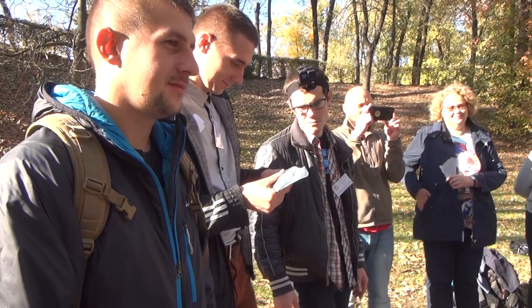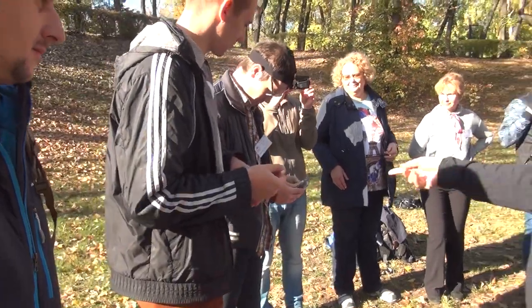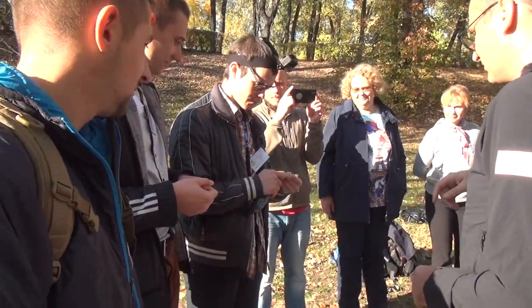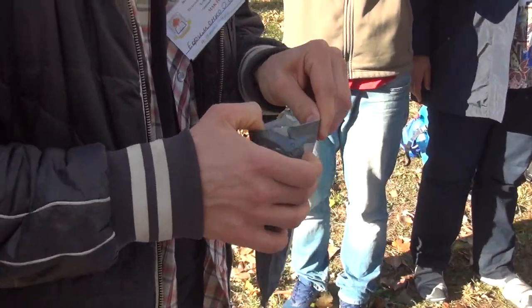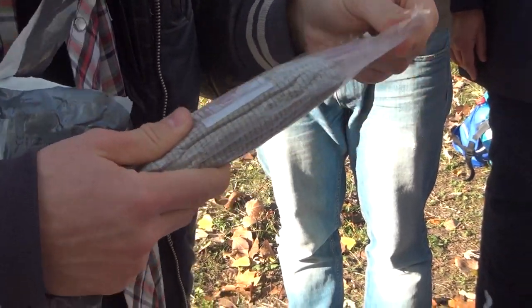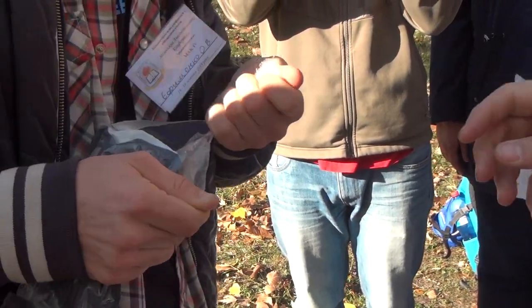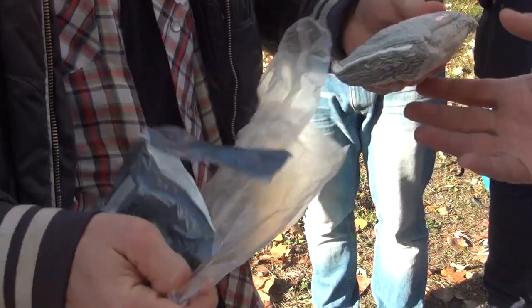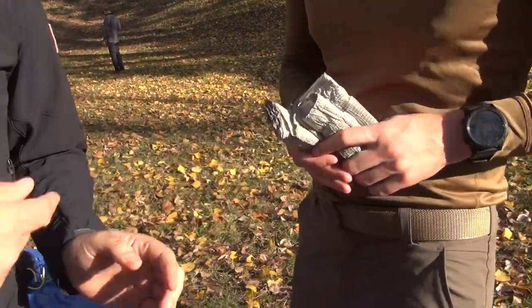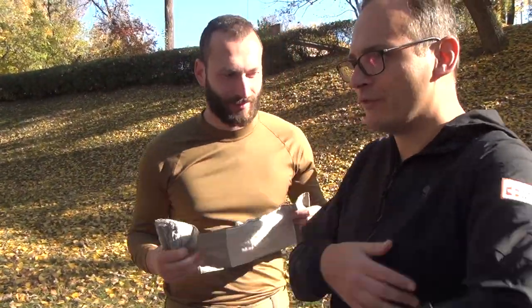But the trick is, what's that? Are these the ones you can show? Yep, no problem. So if you open it, just open it. Take it out and see if it's an old-fashioned one or a modern one. Pull it open. Oh, I think this is actually an Israeli bandage. Okay, sorry, this is not a hemostatic gauze, this is an Israeli bandage. Maybe you can show best how to use this one, because she has the most experience with it. For bandage, like for example in the armpit.